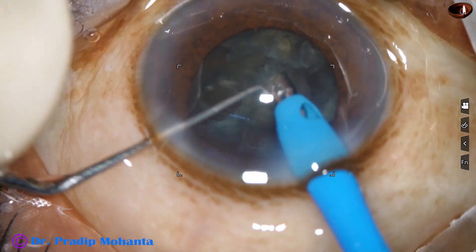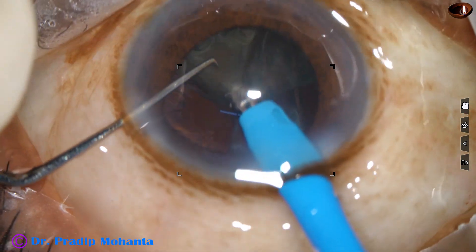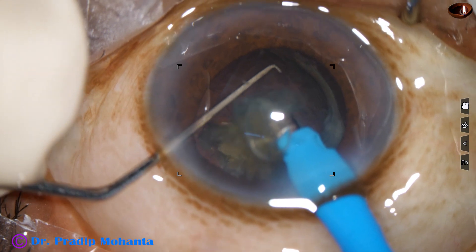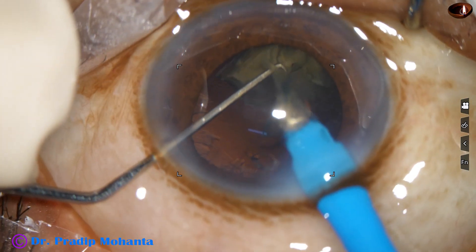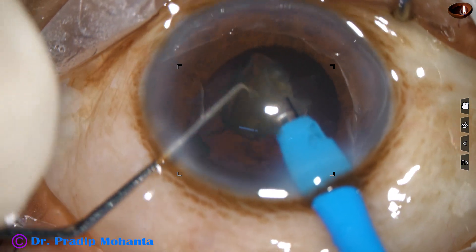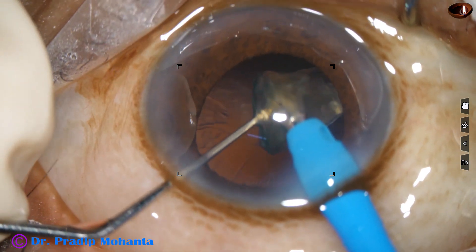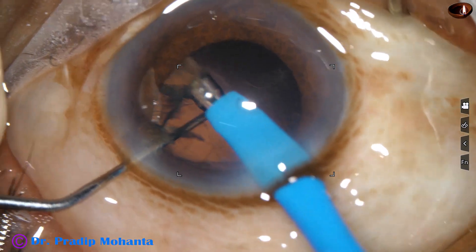Now this is the last nuclear piece. At this point, vacuum is reduced to 350 mmHg and flow rate to 35 ml per minute. Emulsification is carried out slowly while watching the posterior capsule to see whether it is moving forward. If there is any trampolining of the posterior capsule, a scaffold technique will be used. With low vacuum and very slowly, the last piece is emulsified — the epinuclear shell is protecting the posterior capsule.